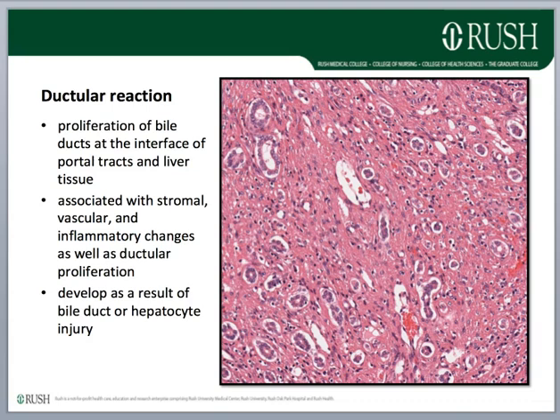It's associated with a variety of stromal, vascular, and inflammatory changes that you don't really readily see on the microscopic slide, but it manifests as this proliferation of bile ducts. So it's kind of analogous to pathologists. There's so much more than meets the eye.